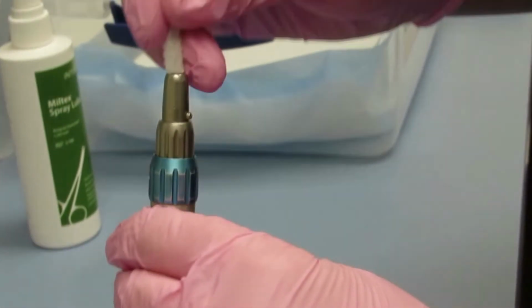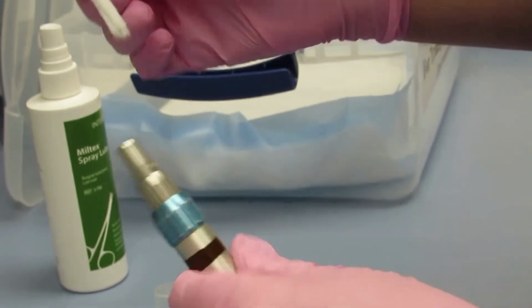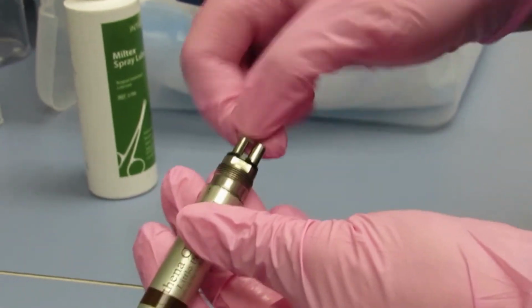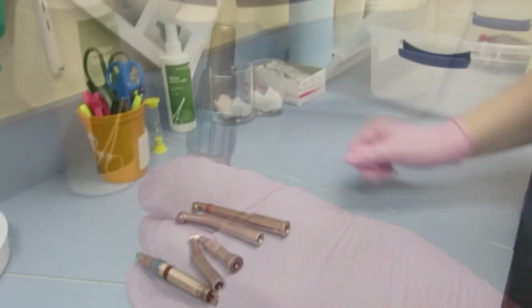This is a straight, low-speed handpiece. Insert the pipe cleaner into the top part of the handpiece. Be cautious to insert the pipe cleaner into the drive air tube. This tube is the same tube the lubricant is applied to. The drive air tube is the shorter of the two big tubes at the back of the handpiece, and it is a gold color on the newer handpieces.